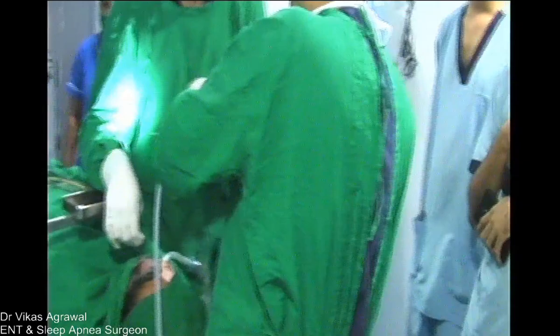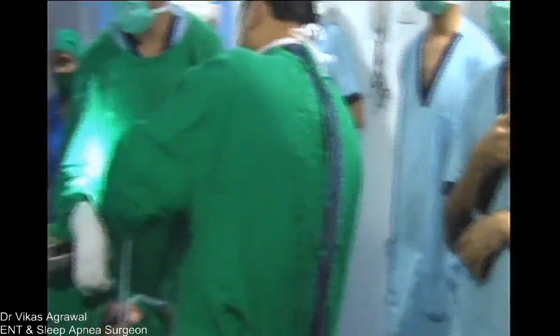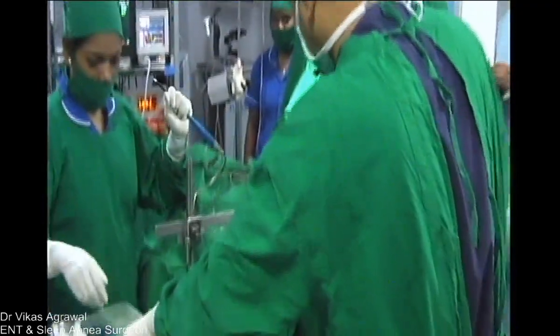So we have to put a correct size mouth gag so that the base of the tongue is exposed and the anterior 2/3 of the tongue is not exposed.